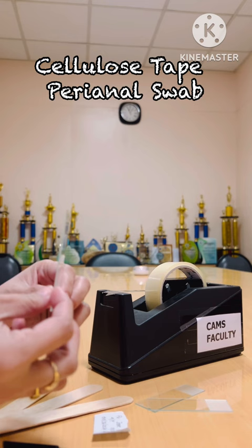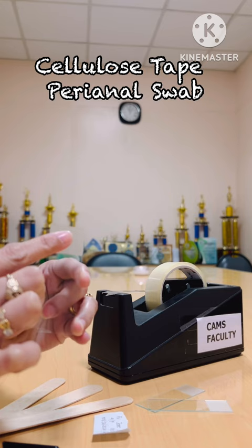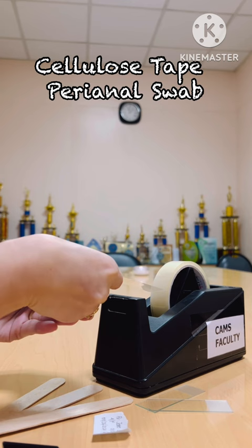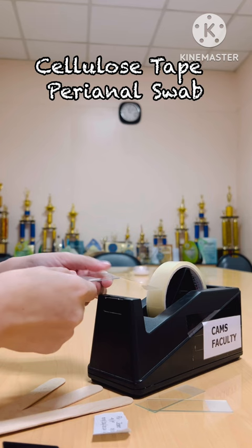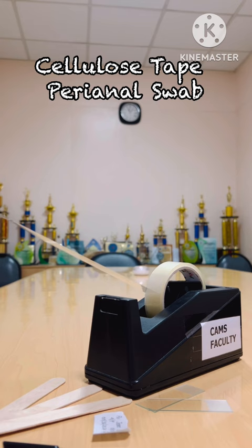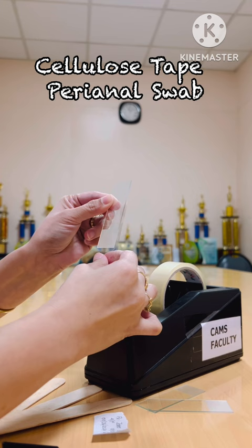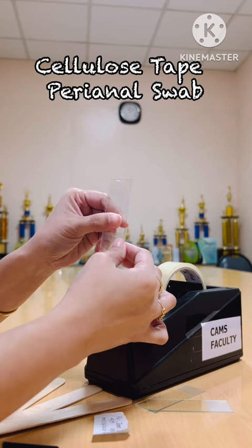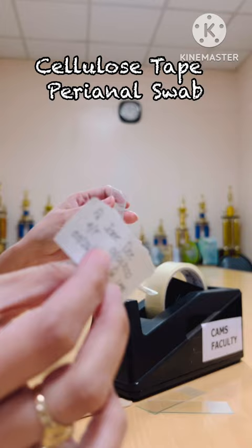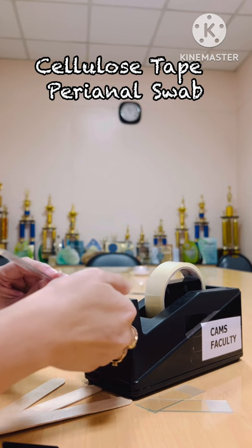First, get your glass slides. Make sure that you identify the frosted end and the back end. What we need to do is attach at least three-fourths of the scotch tape to three-fourths from the back of the glass slide — at the back. Then run it over going to the very edge or end of the front portion of the glass slide. We need a little bit of space for the label in this area.